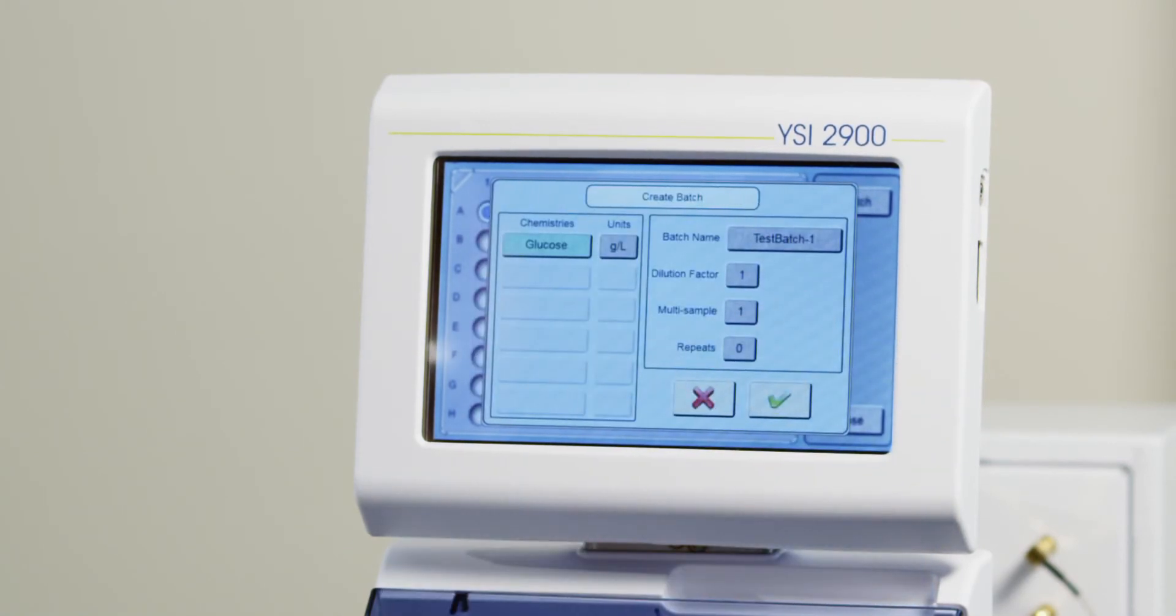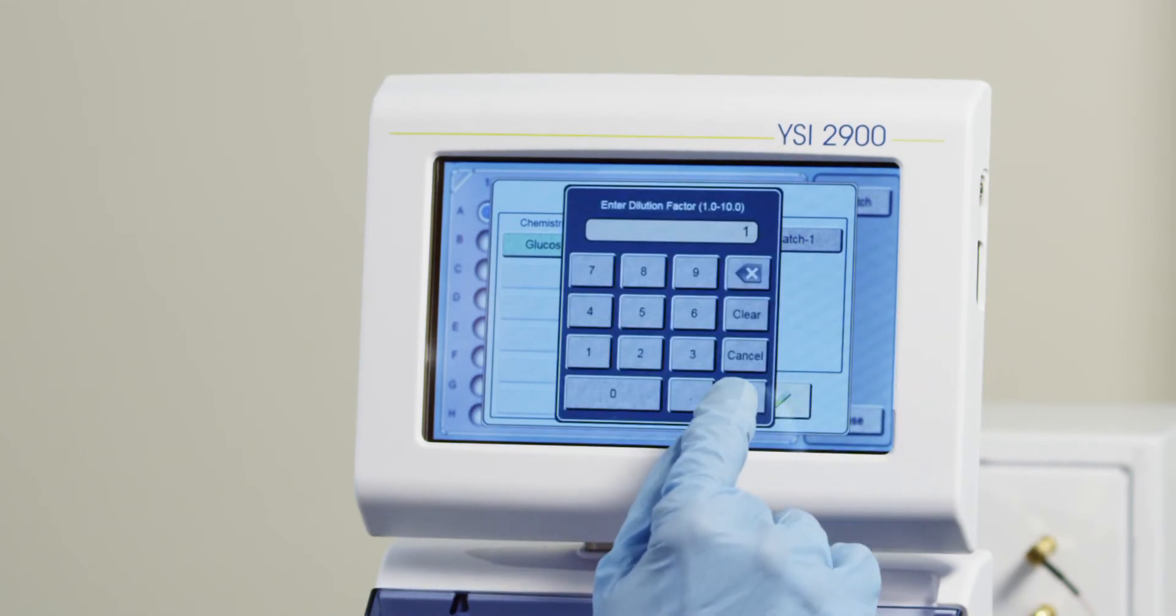If your samples are diluted and you would like the instrument to account for this dilution factor, touch Dilution Factor, type in the dilution factor desired, and press OK.